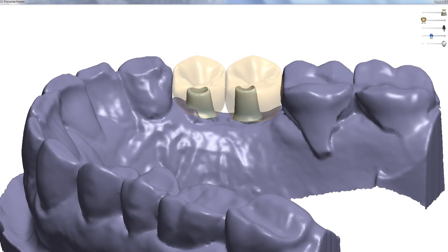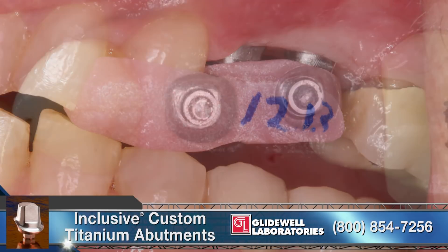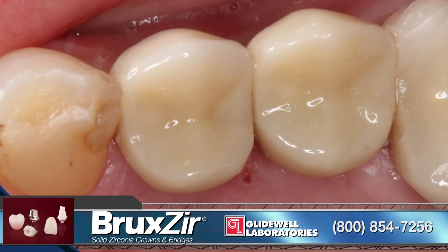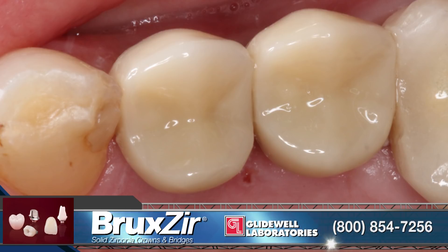The final impression was made using vinyl polysiloxane material. From this impression, a master cast was made at Glidewell Laboratories, and they fabricated custom titanium abutments. The final single unit crowns were digitally designed and milled from Bruxer full-strength solid zirconia. The custom milled titanium abutments were threaded into position in the healthy grafted implant site. The Bruxer crowns were cemented over the custom abutments and exhibited a natural aesthetic appearance.